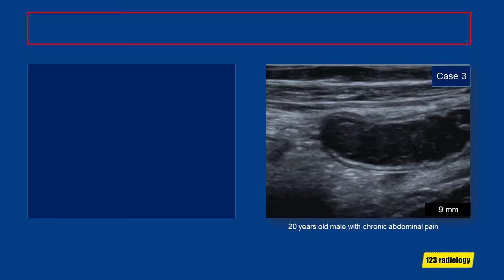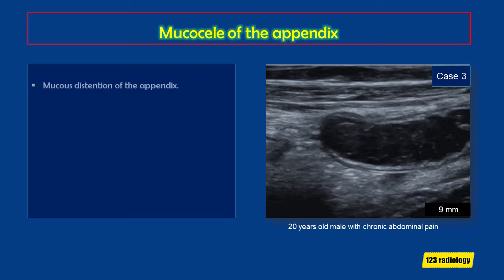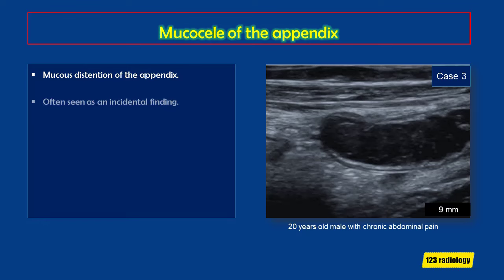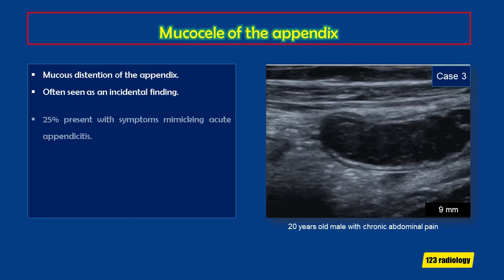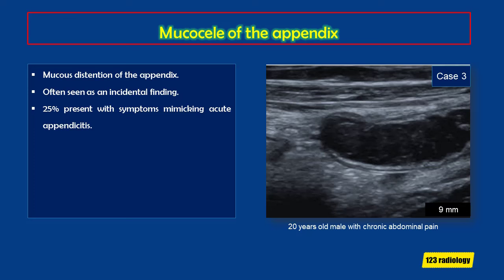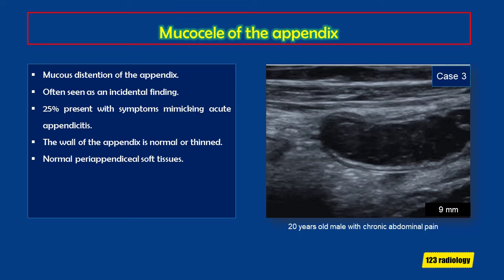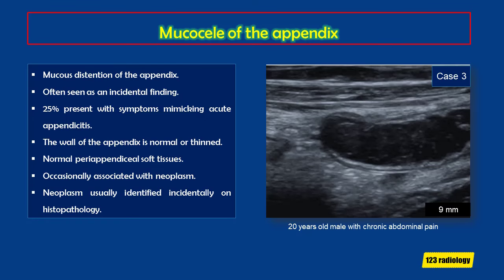This is a 20-year-old male with chronic abdominal pain. The appendix is enlarged at about 9 mm with its lumen filled with fluid. The appendiceal wall appears normal and the peri-appendiceal tissues are also normal — this represents mucocele of the appendix, which is mucus distension of the appendix. It is most often seen as an incidental finding, but 25% present with symptoms mimicking acute appendicitis. There is no inflammation of surrounding tissues, though it is occasionally associated with a neoplasm, usually identified incidentally on histopathology.